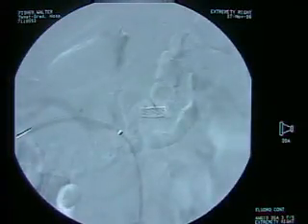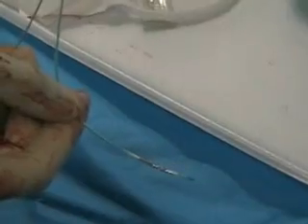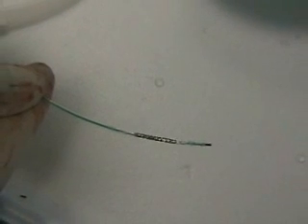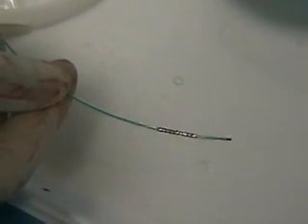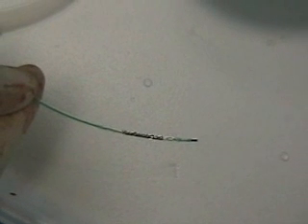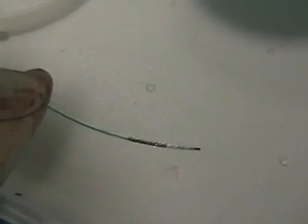This is a metallic stent. It is used to maintain the diameter of the blood vessel. After the balloon dilates the blood vessel, it serves as a metallic scaffolding to maintain patency of the artery. It is very small and is passed over the guide wire. Here we see the markings of the stent.